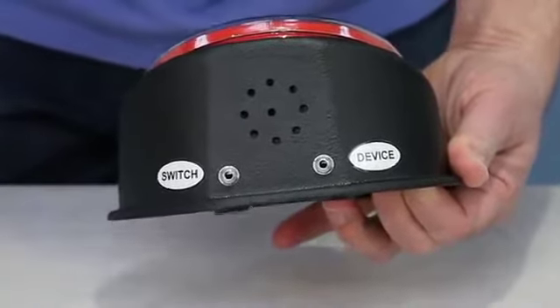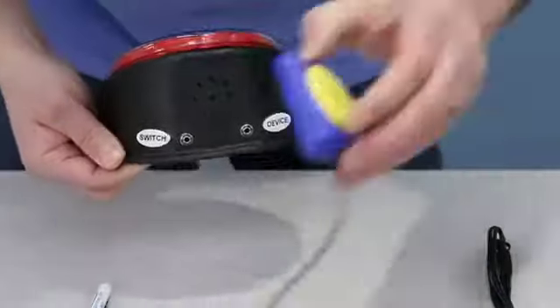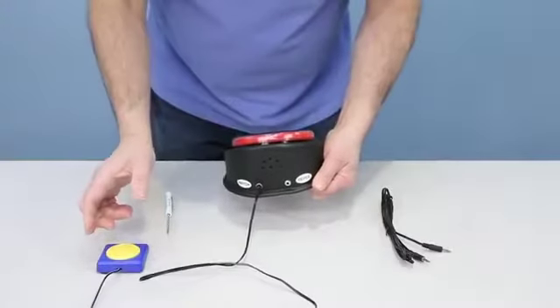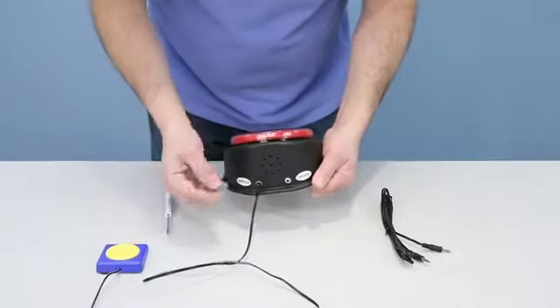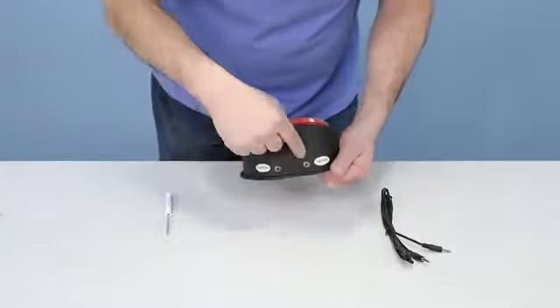You also have the option to use an external switch. If you have a user who cannot use the big button — for example, somebody who needs a head switch — they can plug in an external switch to activate the message. Let's hear it again: 'This is a test message one.' That's a great feature.